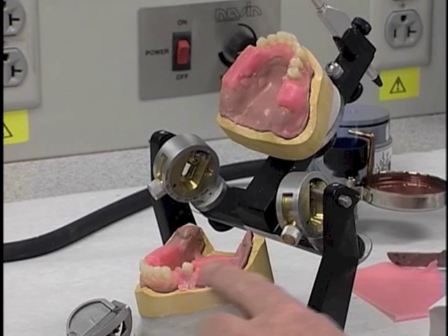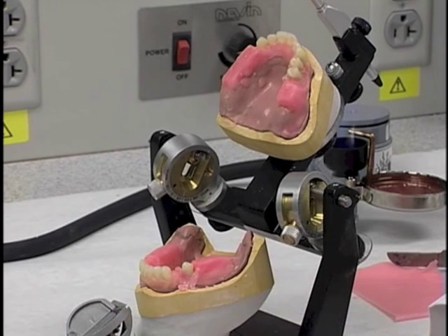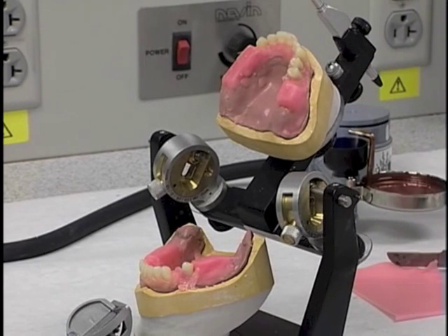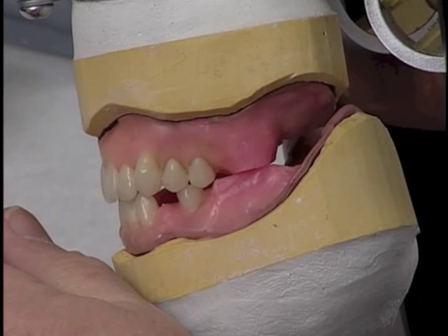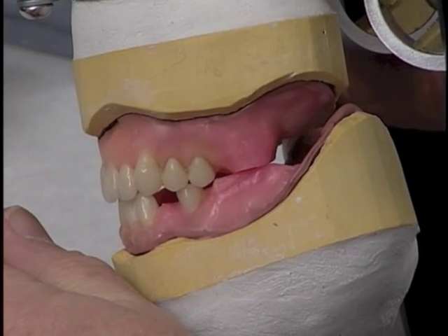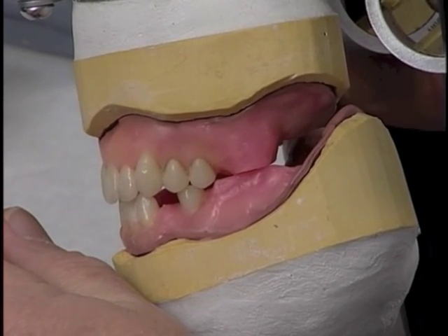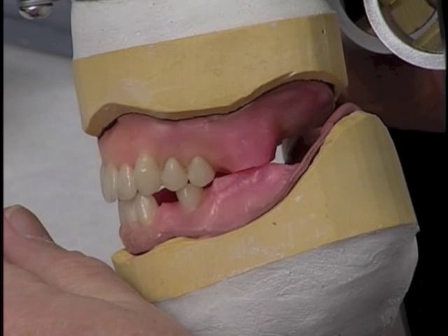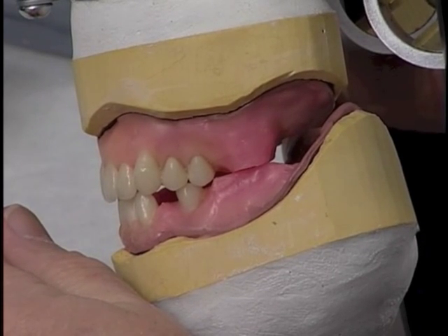We can place the first premolar and 2 molars in here into the position we think they should be, and then we can arrange the rest of the maxillary teeth to occlude properly with them. First and second premolars, that's given us the position where the mandibular second premolar should go, so we have a good idea now about the mesiodistal positioning of all of the mandibular teeth.